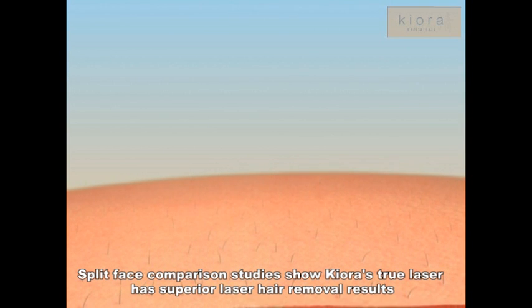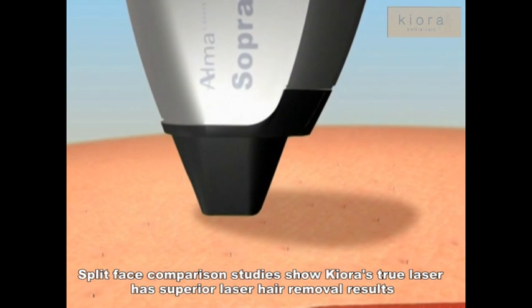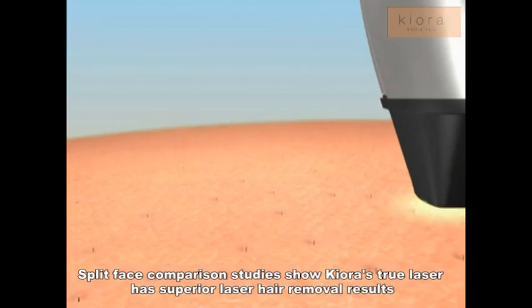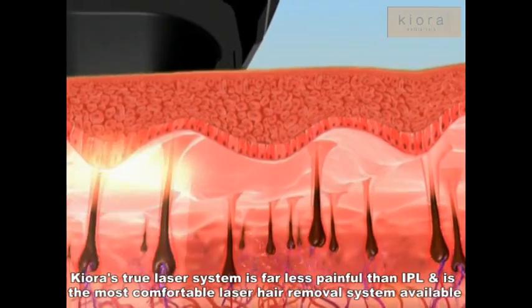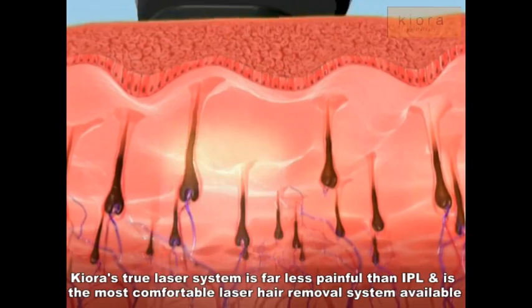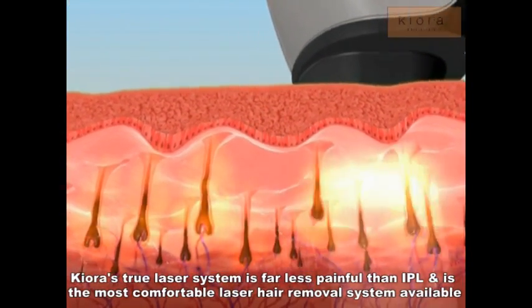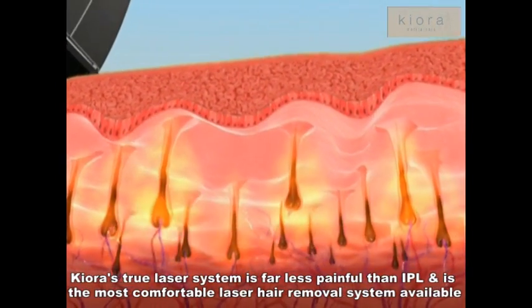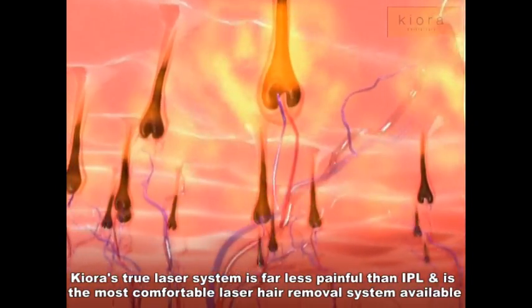The Soprano XL's revolutionary SHR mode provides an ideal combination for efficient hair removal. The SHR mode uses the optimal hair removal wavelength of 810 nanometer diode for deep penetration into the dermis where the hair follicle is located. The SHR mode has consistent high average power capabilities to enable the 10 pulse per second repetition rate for hair removal in motion. The SHR mode enables a low-fluence, in-motion approach for virtually painless hair removal.